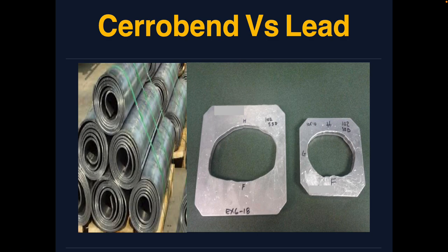And usually, in most of the books, you will add another 1 mm for more safety. So it will be 8 mm and add another 1 mm for safety. You will end up with 9 mm. In some centers, they use 1 centimeter for all, and that's it. So they don't bother calculating it.